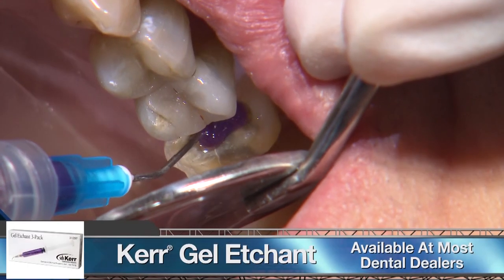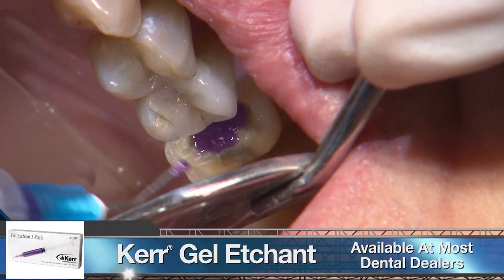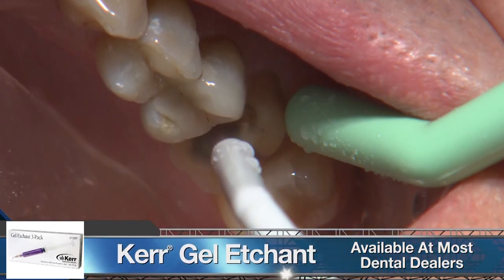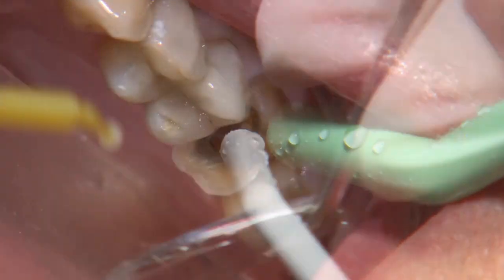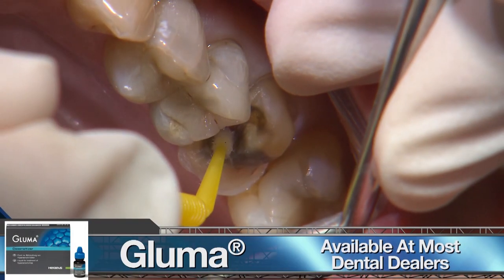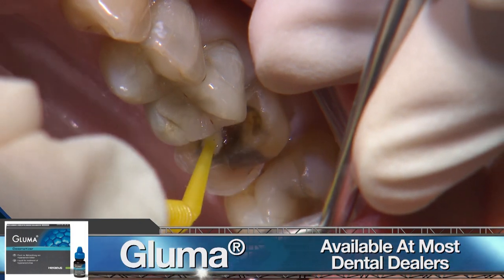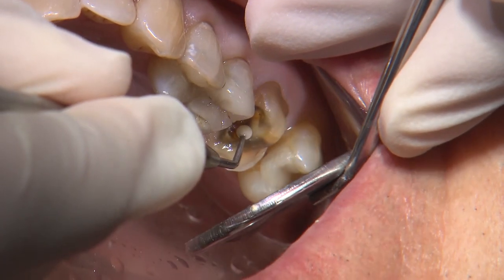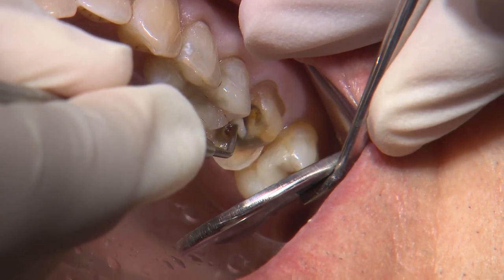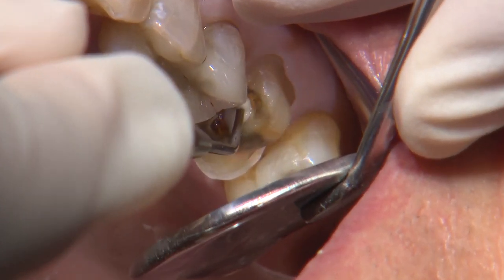Since we're close to the pulp, I'll place a thin layer of Vitrebond glass ionomer for added protection. Glass ionomer does chemically bond to tooth structure, but I like to do a quick acid rinse to remove the smear layer. I used 37% phosphoric acid for five seconds and rinsed that off. I'll then place a one-minute application of Gluma desensitizer, suction off any excess, then apply the glass ionomer.